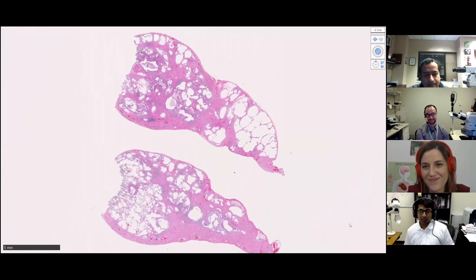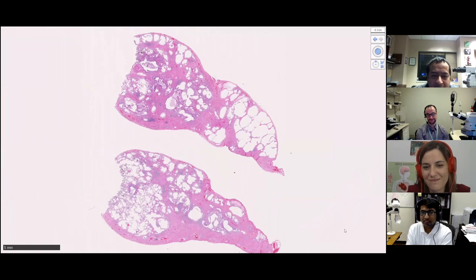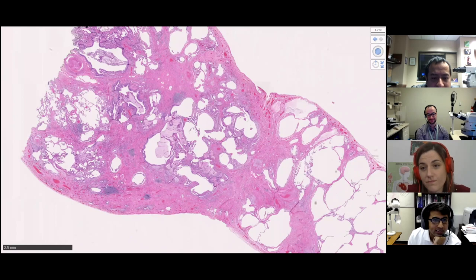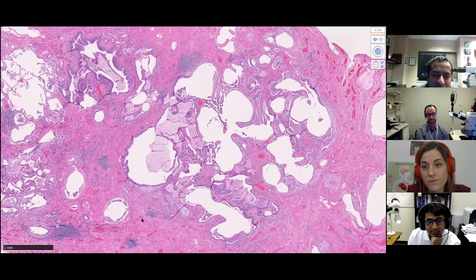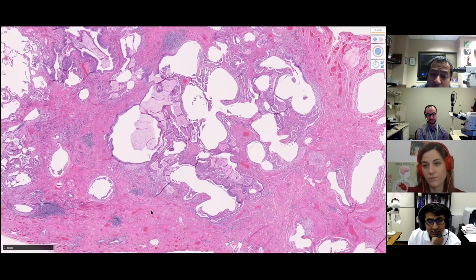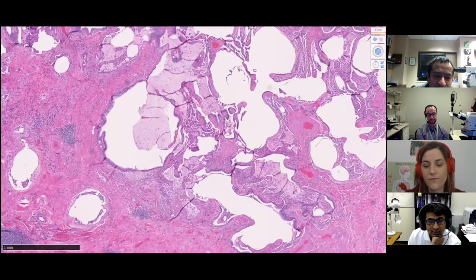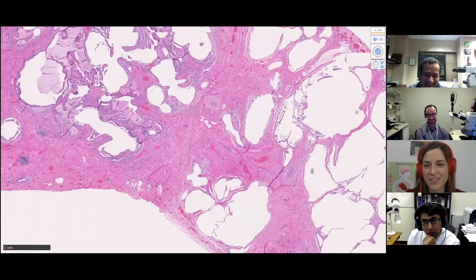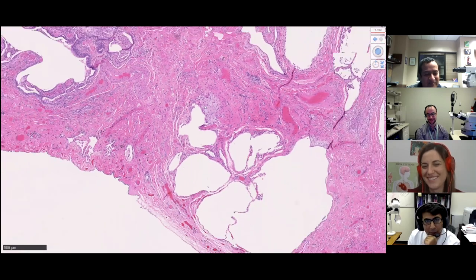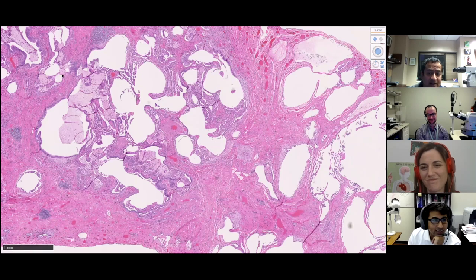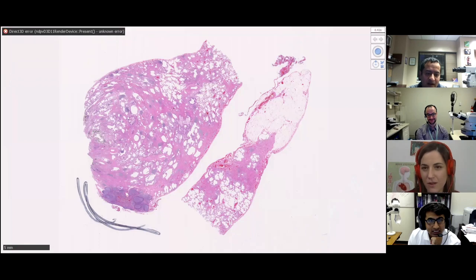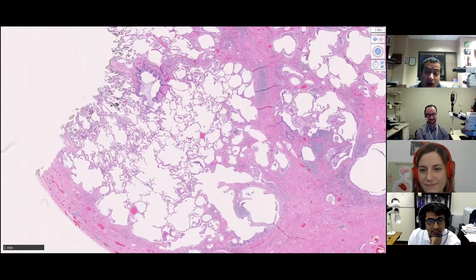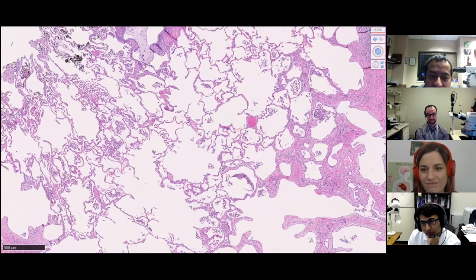This is the middle lobe. Now I think right in the middle of the upper piece there's an area that has at least microscopic honeycombing, and there's a fibroblast focus in the bottom of the largest honeycomb cyst. Things are beginning to get hot and interesting. For me this one I would call UIP - it's getting there. You've got some normal lung on the right side, and on the other side there's almost completely fibrotic lung, with smoker's macrophages visible in the alveolated normal lung.